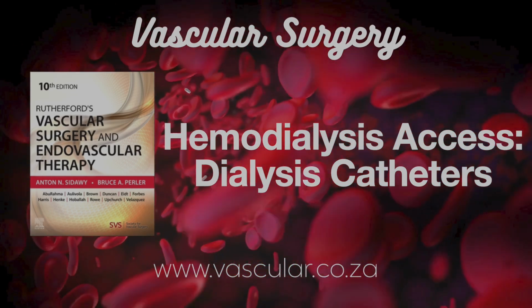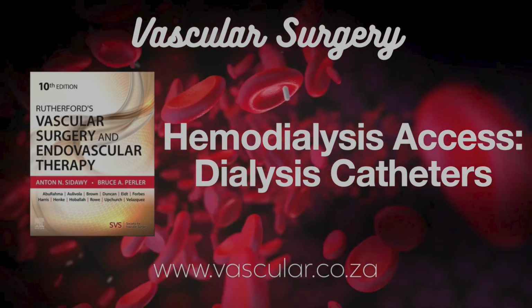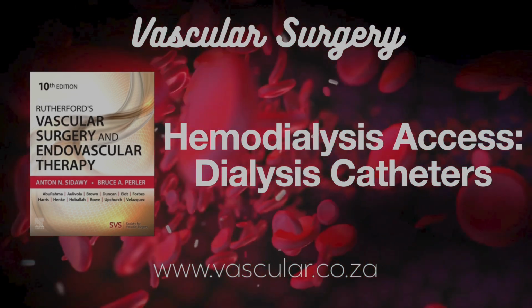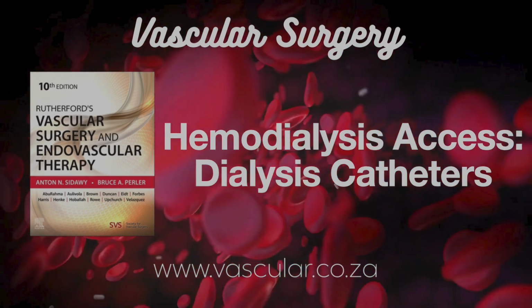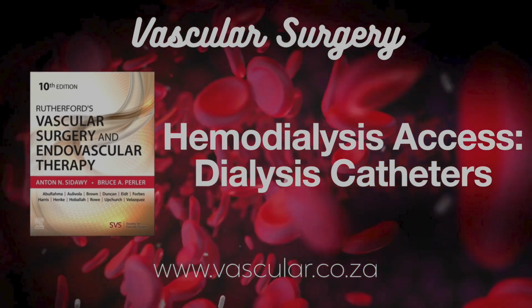Treatment for stenosis. Angioplasty, often with stenting, is the preferred approach. But keeping them open long-term is tough. Primary patency rates aren't great, meaning they often narrow down again quickly. Requires repeat procedures usually.